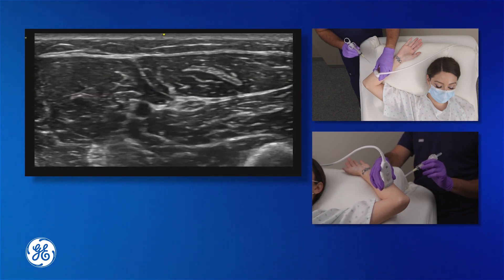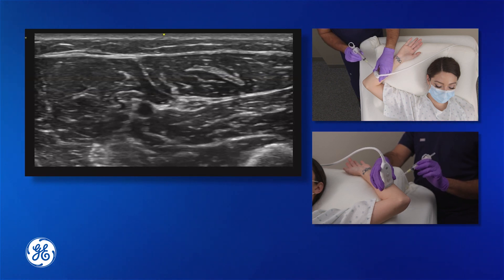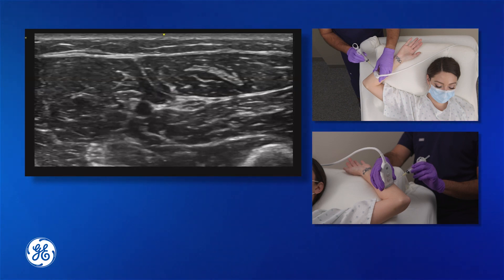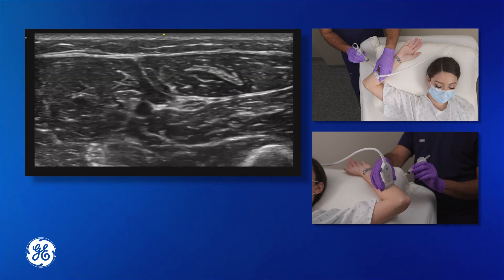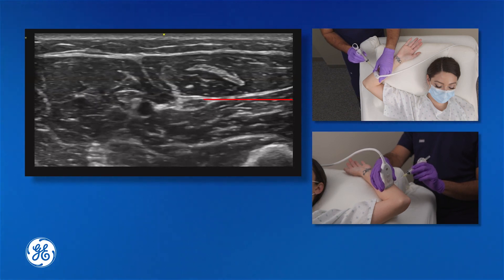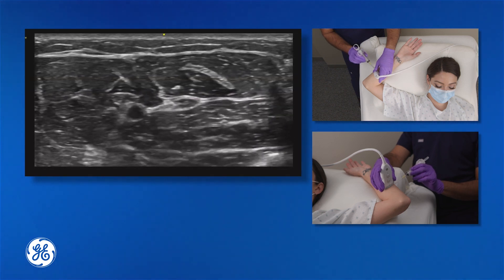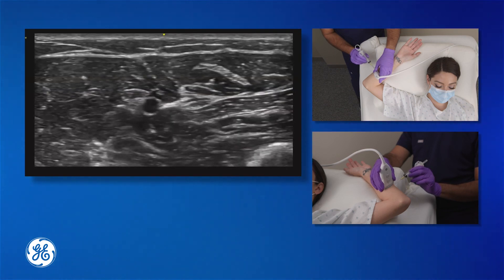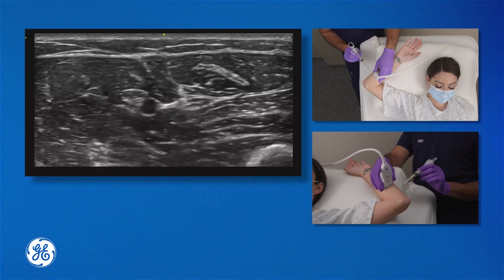Rather than having the needle inserted right where the transducer contacts the skin, oftentimes it's best to drop a centimeter or two in depth, depending upon where the nerve is visualized on the screen, and insert the needle there, because that allows for the needle to come in straight for easy visualization. The goal is to surround the entire nerve with anesthetic, which then allows for full anesthesia to the distribution of the ulnar nerve in the hand.